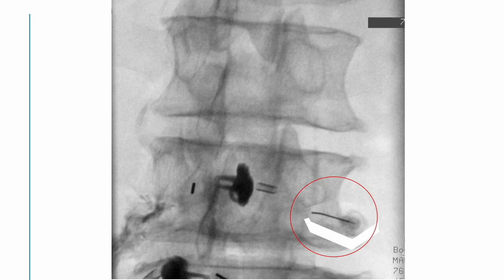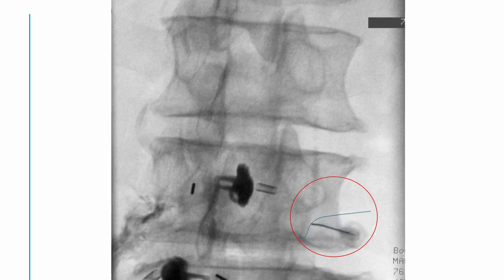The ideal entry point and target for the right L4 transforaminal approach should be here. But I cannot enter there because of inferior displacement of the transverse process and hypertrophic articular process, so I had to go more inferiorly.